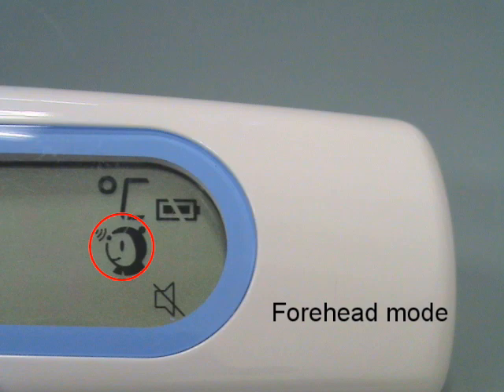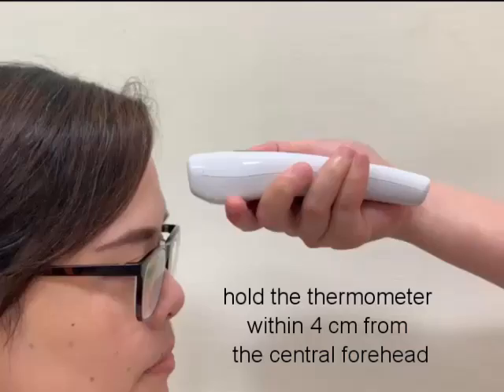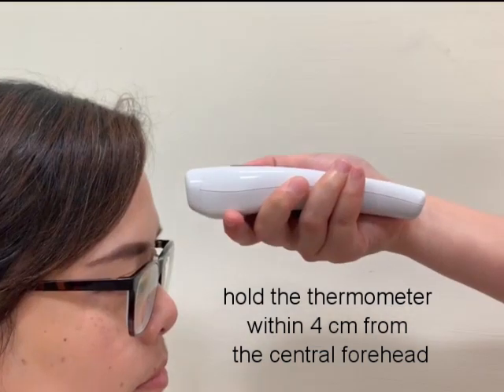Forehead mode is the default mode. Hold the thermometer within 4cm from the central forehead and press the button to get the forehead measurement. The measurement takes approximately one second.